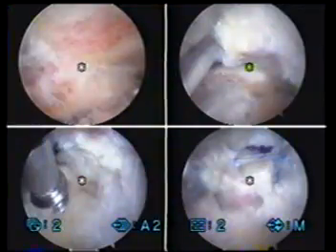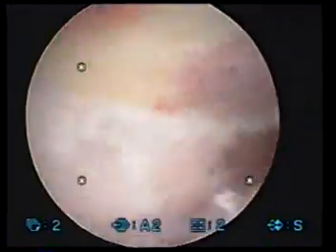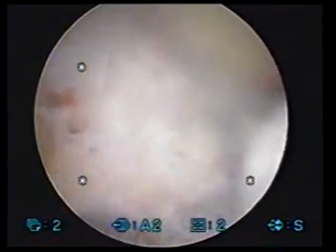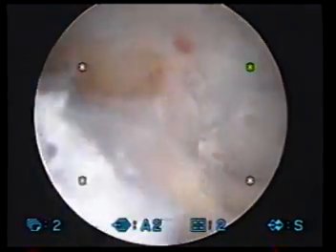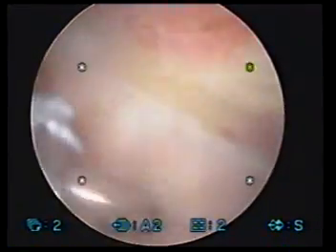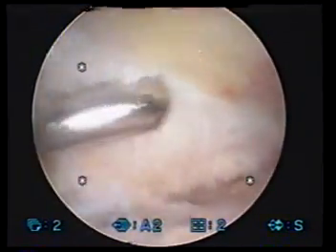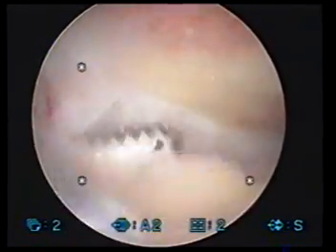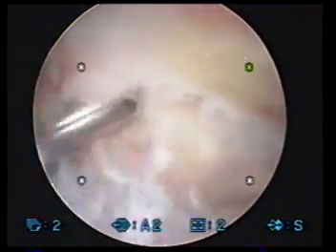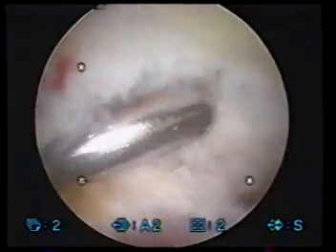The bone spur is gone now. We're going to look at the end of your collarbone joint next. We'll come right in behind here, and behind this soft tissue here is your collarbone. The collarbone typically has a tendency to wear a little bit. We saw on your plain films and MRI scans irritation at this joint. That's typically where these bone spurs start to form from. What we do is some preventive maintenance — we're here to decompress this collarbone joint, make sure it can't become a problem down the road. What we're going to do is expose it, take a good look at it, and see if we need to take any bone spurs off. I think we probably will based on the initial inspection.